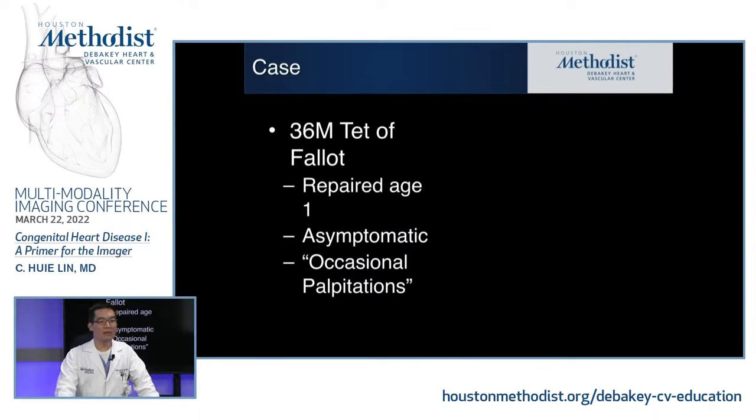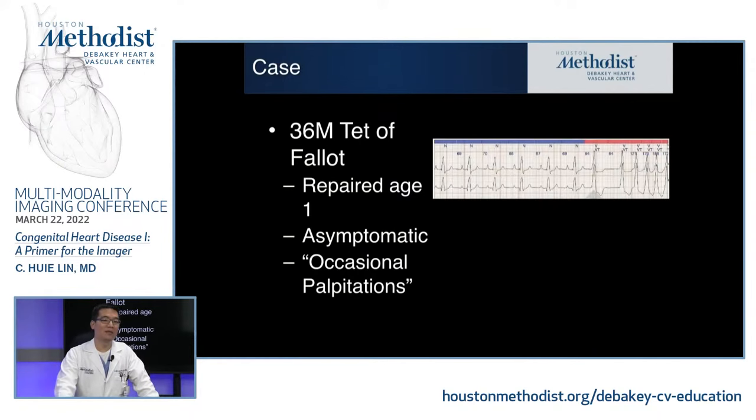Well, we know that the patient probably has at least moderate, if not frankly severe, pulmonic regurgitation, and so we have a concern about what these palpitations may signify. And so we have him wear an event monitor, and this is what we get.